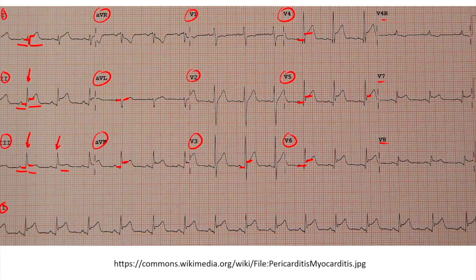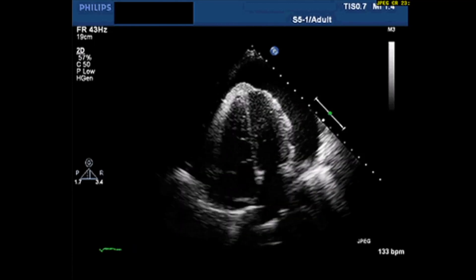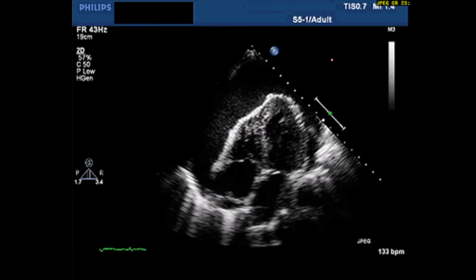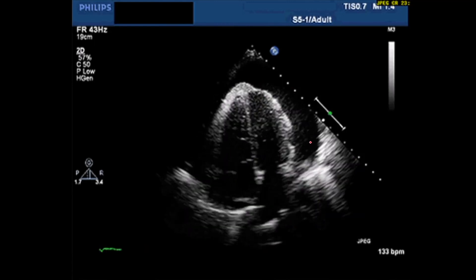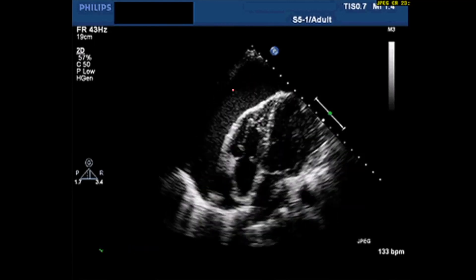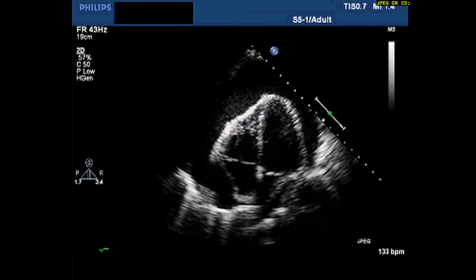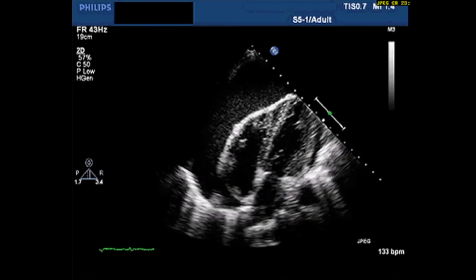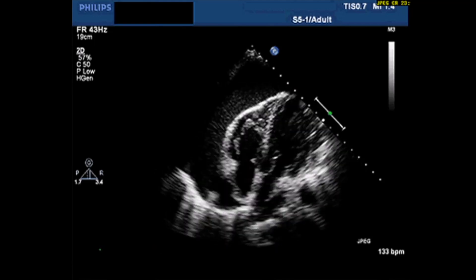Here is an ultrasound being done on the heart. As you can see, the heart is floating around in fluid all around it. This is a sure sign on echocardiogram that the patient has pericardial fluid around the heart, and this may actually represent pericardial tamponade.